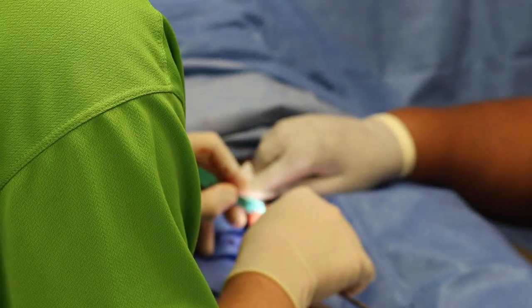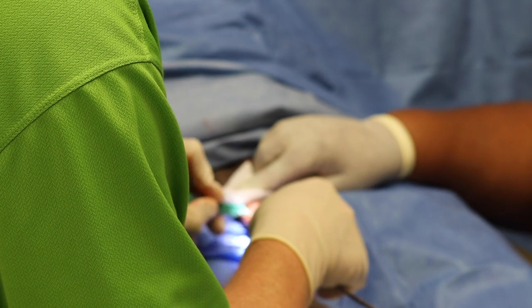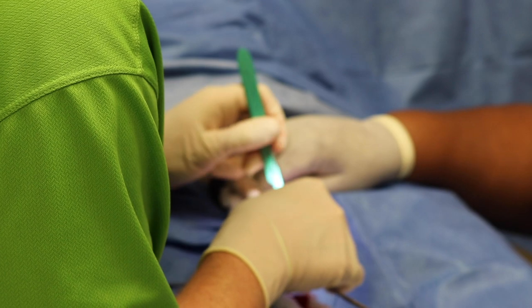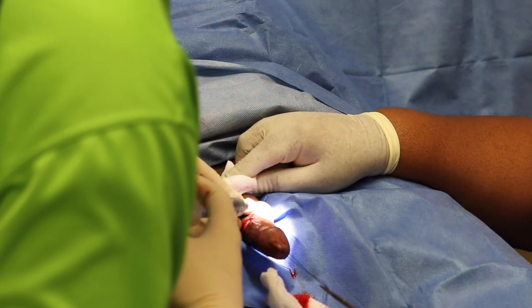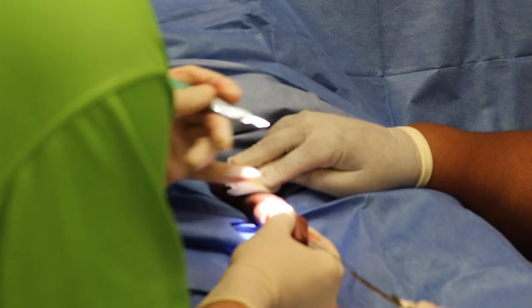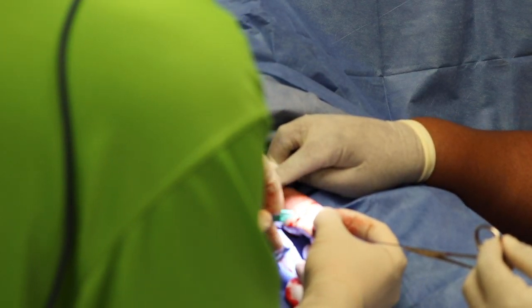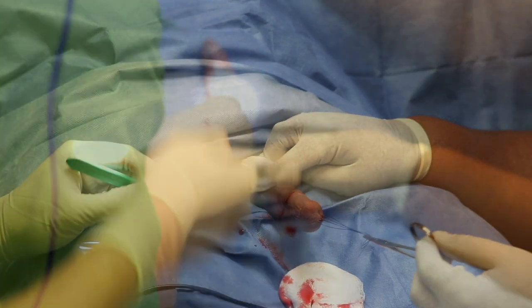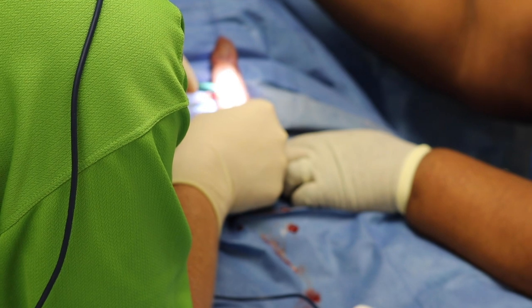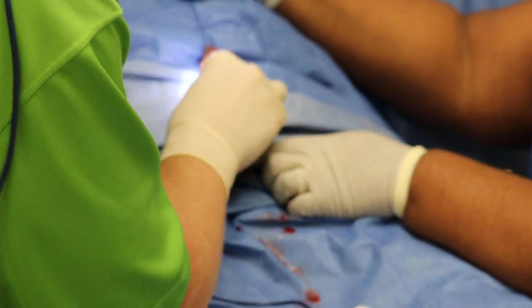Again, the first incision is made approximately 2 centimeters behind the head of the penis. The patient is fully numb and also has a muscle relaxer sedative on board. The incision is carried around the circumference of the penis.